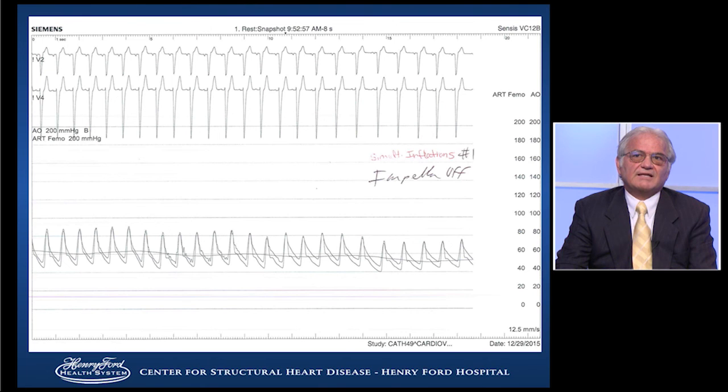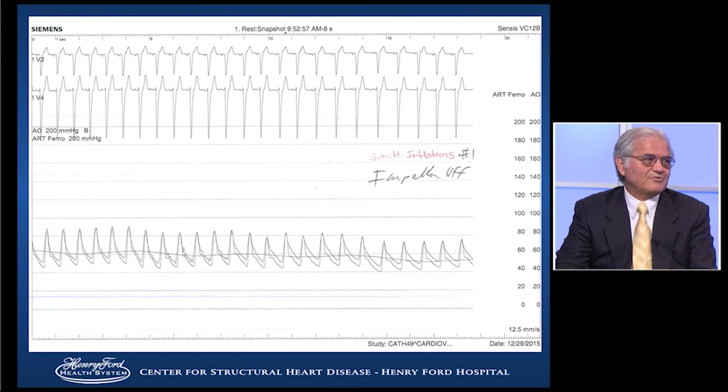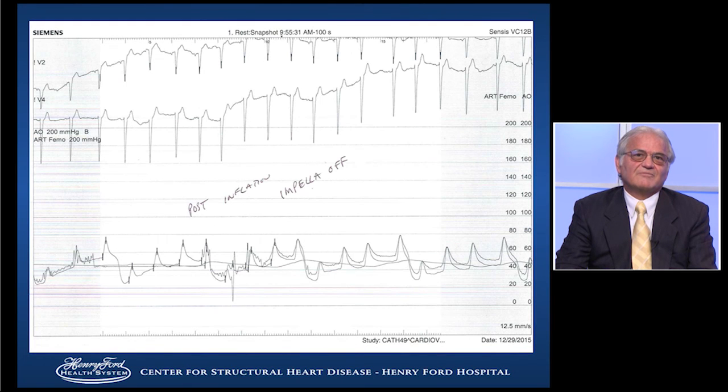This is the patient with 3 liters of Impella flow. We put the Impella catheter in, and then we did a very quick balloon inflation of the left main LAD without support. And this is what happens to the patient. The blood pressure is on a scale of 80, and with the balloon inflation, inflate, deflate, the blood pressure drops. Basically, there's no myocardial support. The patients are dying.